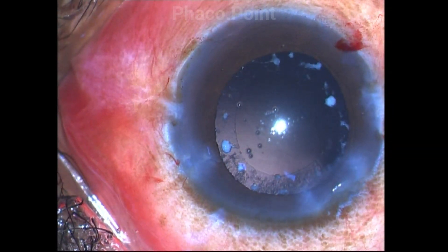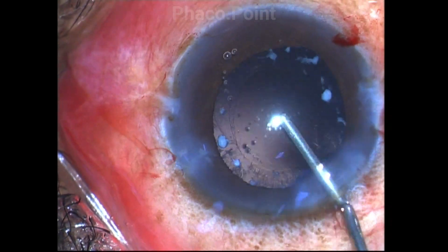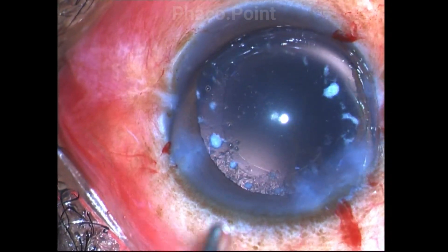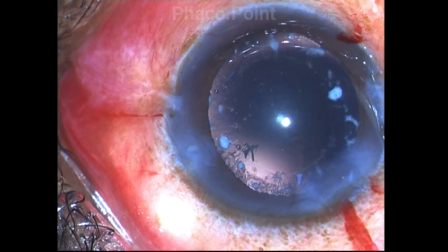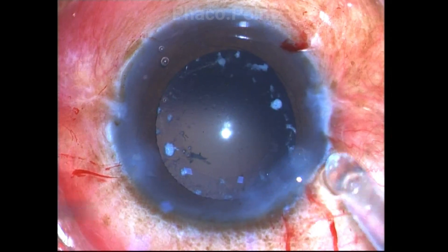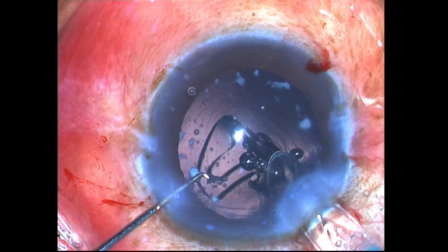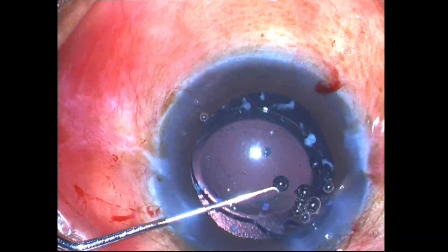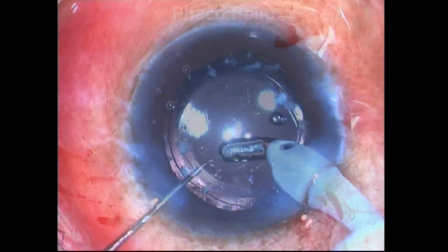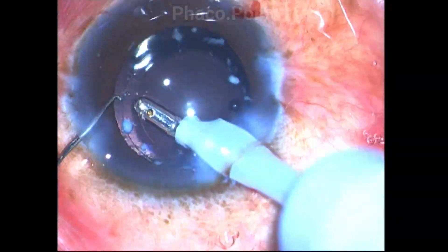I can see strands of cortex in the periphery, and I desist from trying to remove them at this stage, because I know the zonules are weak. The posterior capsule is probably thin and inadvertently engaging them could create zonular dialysis or a posterior capsular rent. So I first implant the intraocular lens — in this case a hydrophilic lens — and once this lens is in the bag, it will help to stretch the equator of the bag, giving me protection while I remove the remaining cortical remnants.